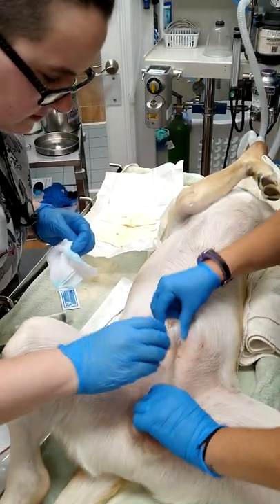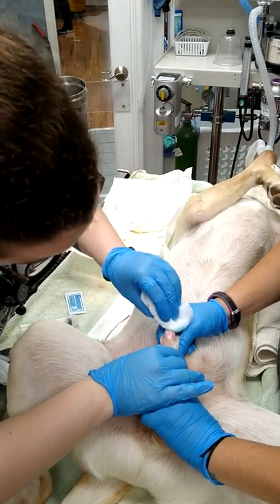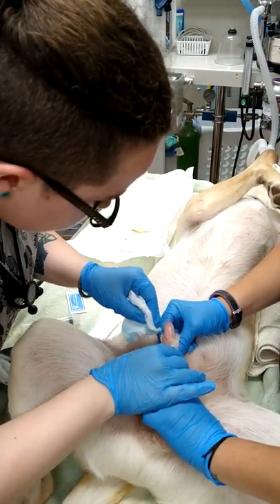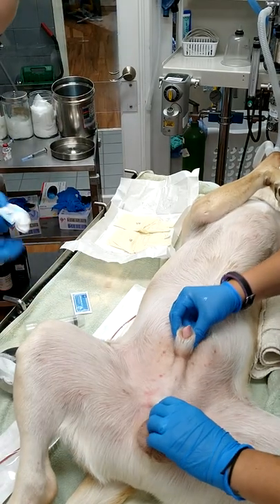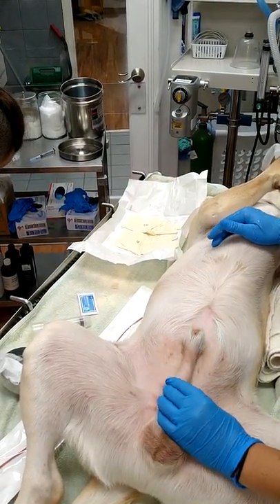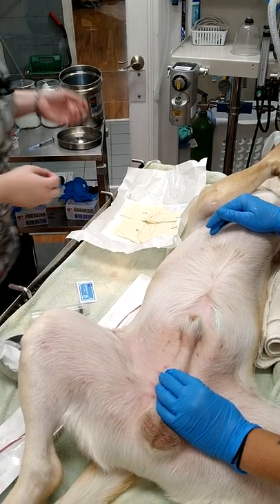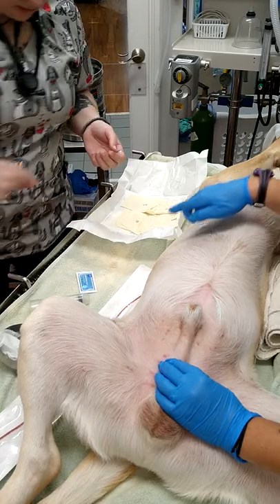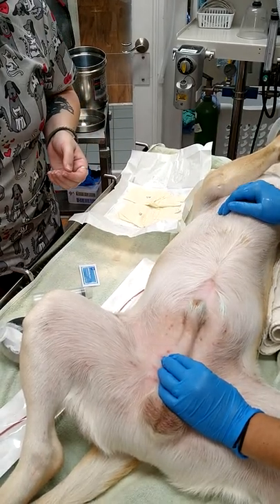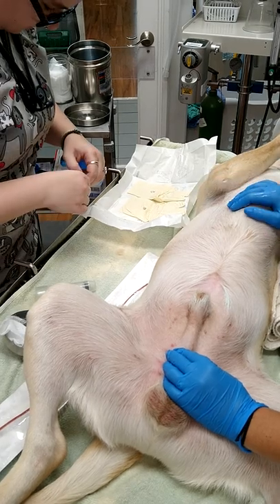Open this. Open this. Put your sterile lube on and open the cap there before you put your gloves on. And you can squirt your lube right on the corner of that.